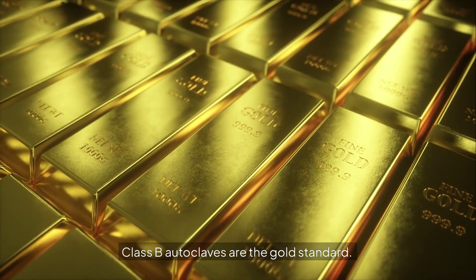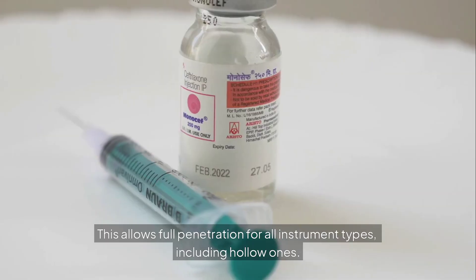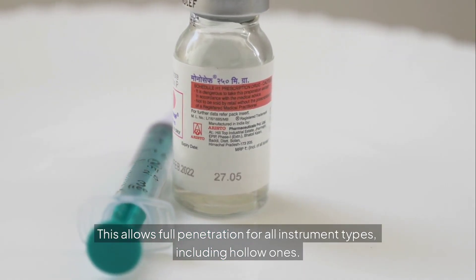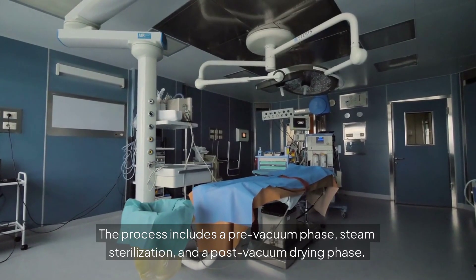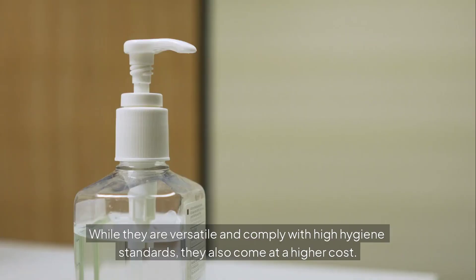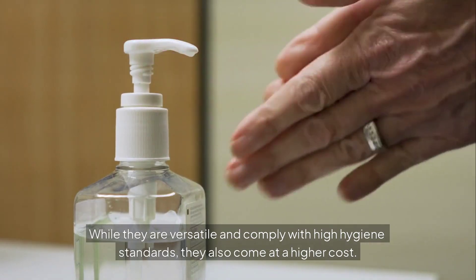Class B autoclaves are the gold standard. They use a vacuum pump to remove air before introducing steam, which allows full penetration for all instrument types, including hollow ones. The process includes a pre-vacuum phase, steam sterilization, and a post-vacuum drying phase. While they are versatile and comply with high hygiene standards, they also come at a higher cost.